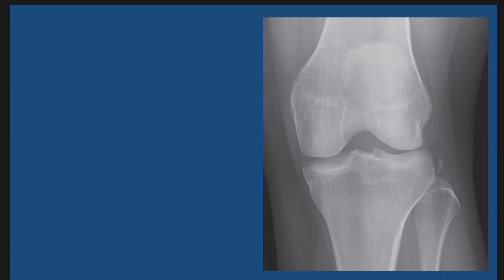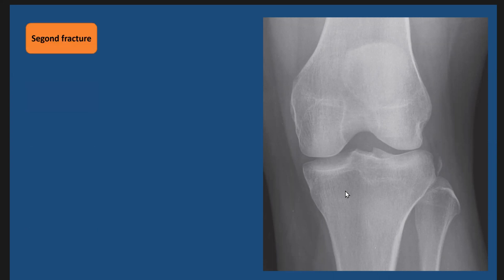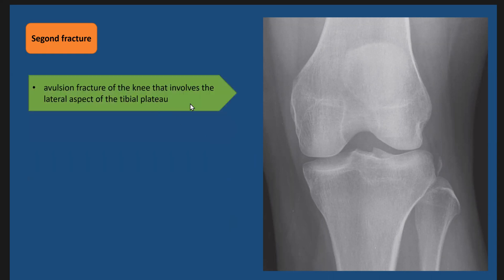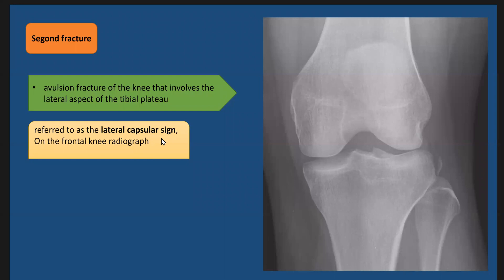This is a case discussion. As we see on the frontal X-ray of the knee joint, we have an avulsion fracture. This avulsion fracture arises from the lateral aspect of the tibial plateau and it is called the Segond fracture. On the frontal X-ray, it is called the lateral capsular sign.